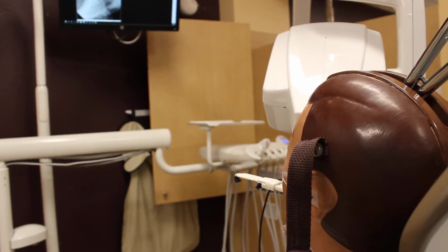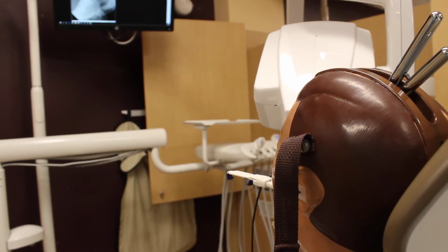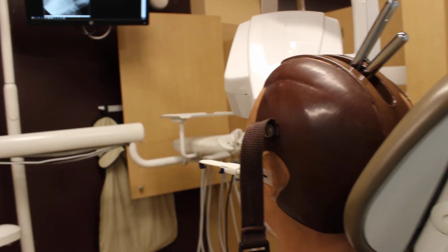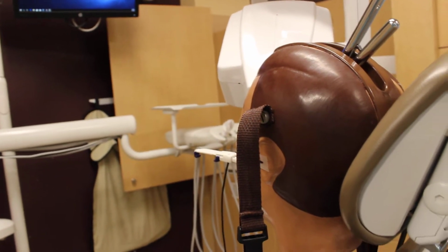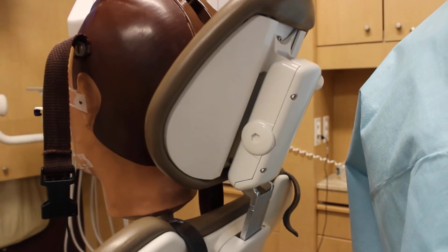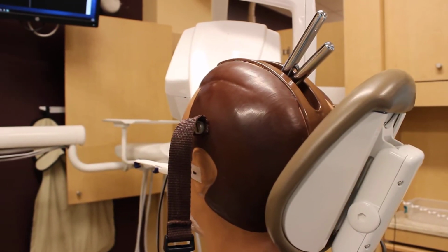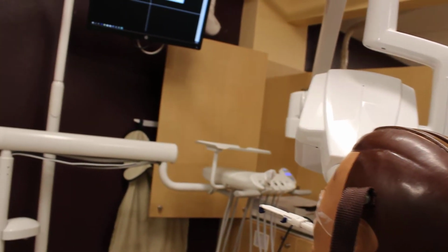Okay, let's try it again. Let me hit cancel. Oh, now it's giving us another one. There we go. I guess it closed completely. When I took the sensor out, it has to restart. There it goes. Just move the whole thing over there again. More mouth. There we go. Next.